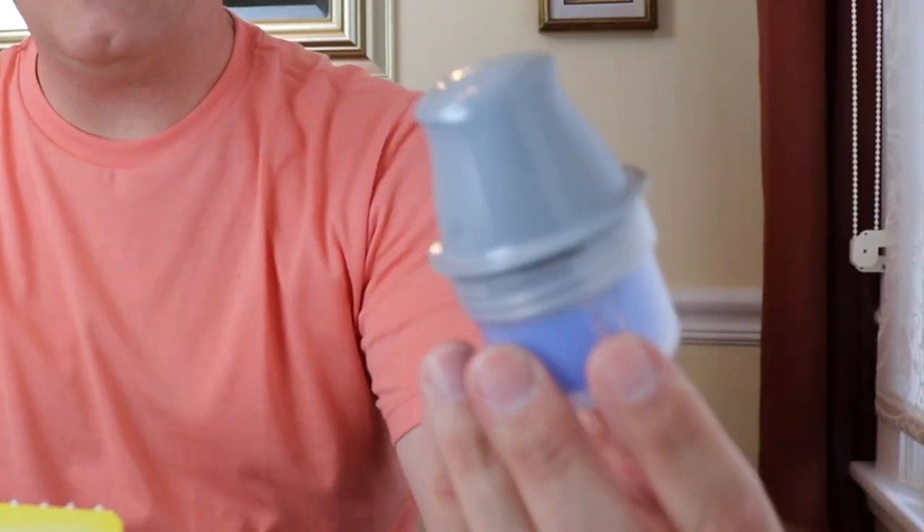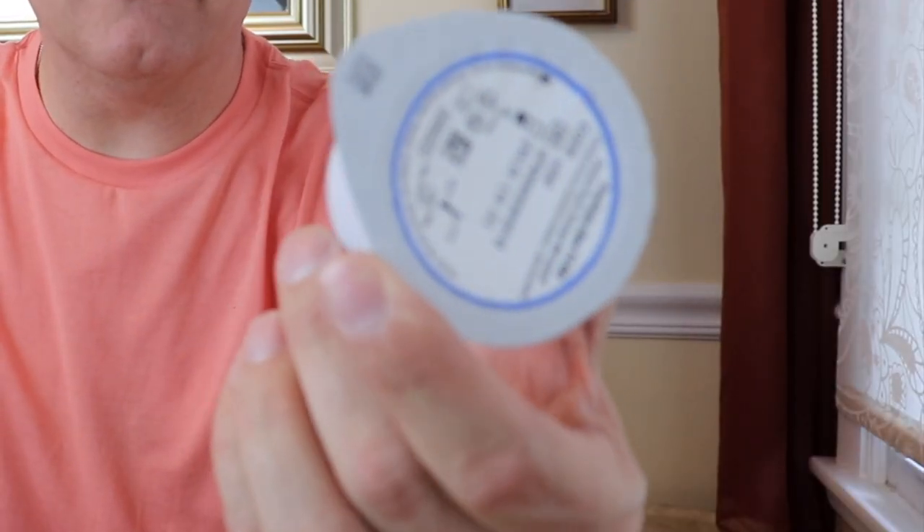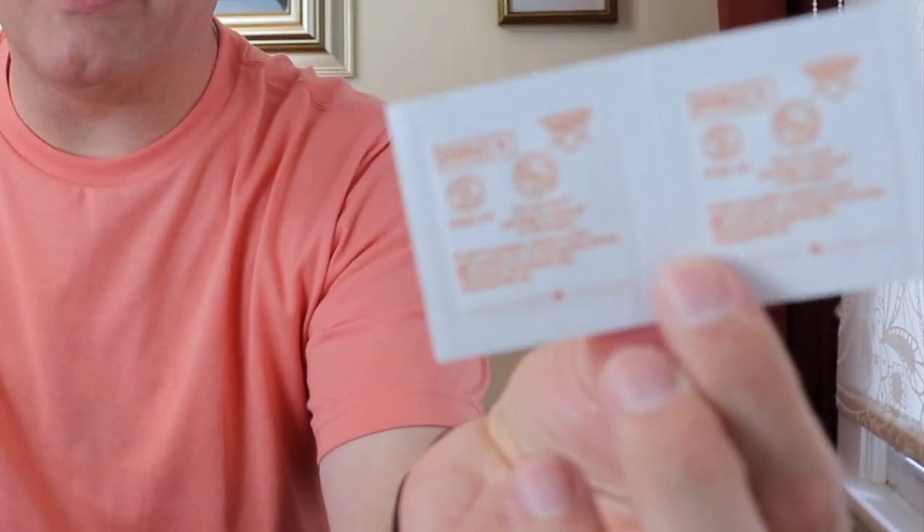So what's in the box? Your legal disclosures. This is your applicator — we'll talk about that in a few minutes. This is the actual sensor itself. And then you have a couple of alcohol swabs.